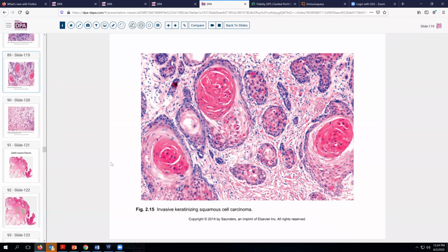So in terms of defining invasion, you of course know the criteria we use: paradoxical keratinization down deep, irregular nests, irregular interfaces, jagged points, and so forth, parakeratotic pearls. Those are all characteristics of typical invasive neoplasia.